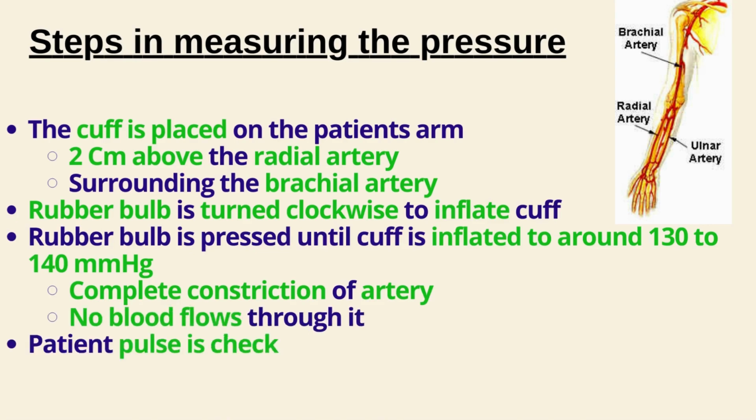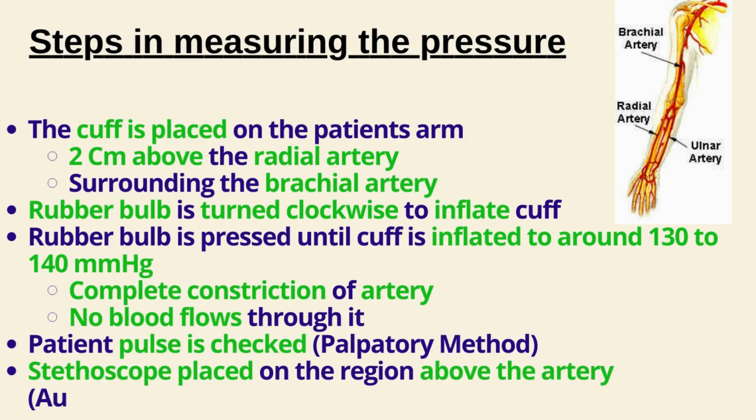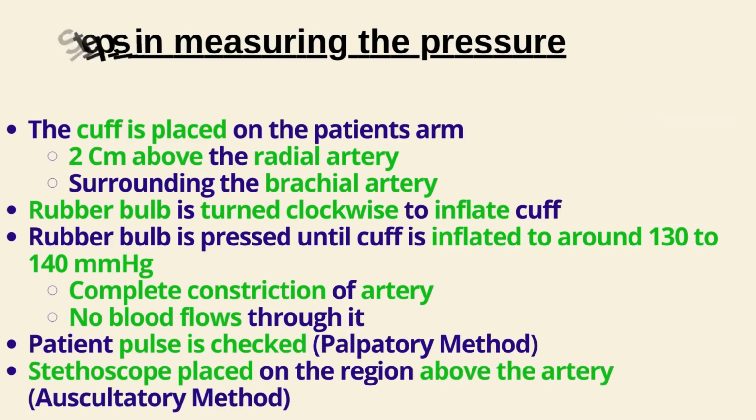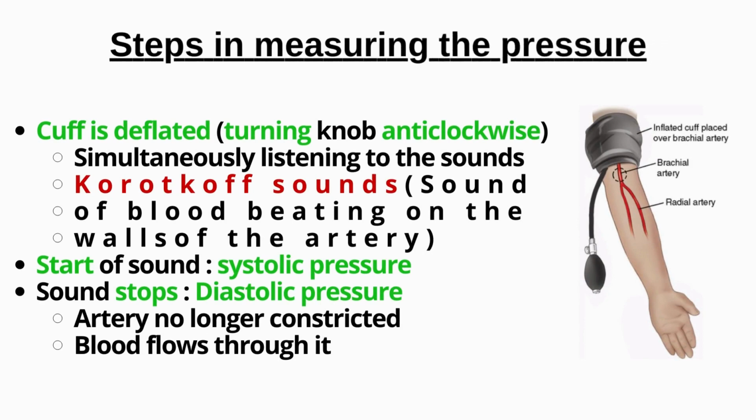Step 3. Inflate the cuff. Use the pump to inflate the cuff to the desired pressure, which is usually indicated on the gauge. The cuff should be inflated until it feels tight but not painful.